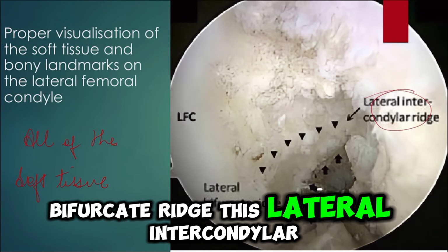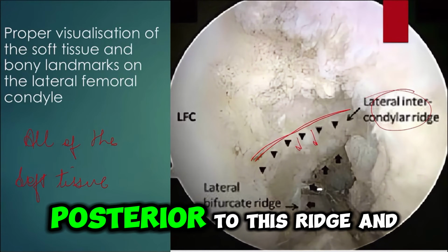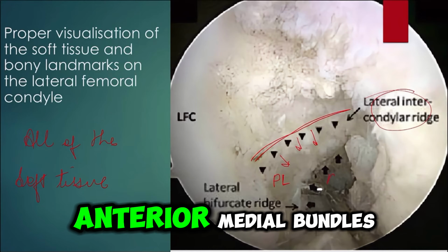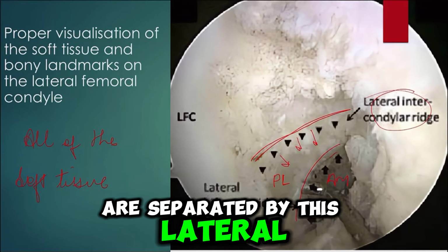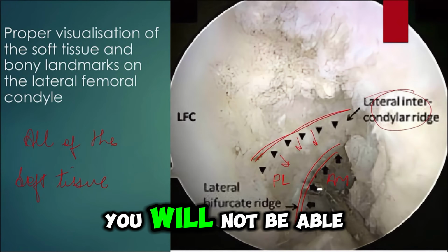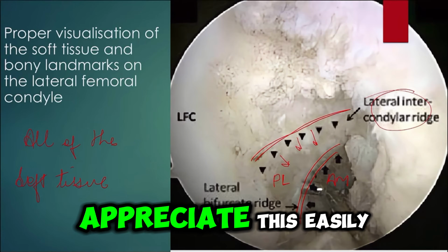As you can see here, this is the lateral intercondylar ridge and then the lateral bifurcate ridge. The ACL is inserted posterior to the lateral intercondylar ridge. The two bundles, the posterolateral and the anteromedial, are separated by the lateral bifurcate ridge. But initially, in your first 20-25 cases, you will not be able to see this clearly. As you go on further in your surgeries, you will be able to appreciate this easily.